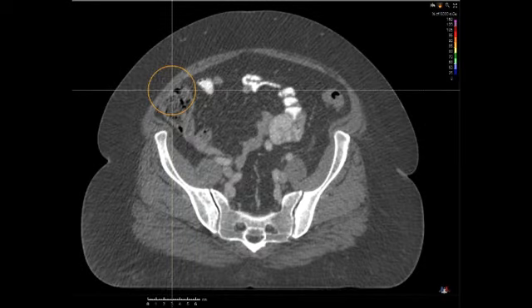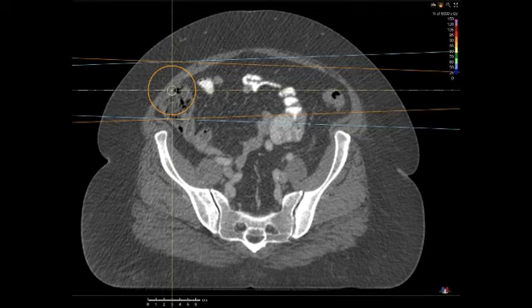Alright, so now I want to walk you through another case scenario that's going to lead into another planning principle. Let's consider that we're going to try to treat some kind of superficial tumor here, a circle. There's no tumor on this image, it's just used for an example. So you want to treat the sphere to an even dose. So we could consider applying the principle that we learned before, using parallel opposed fields like this.